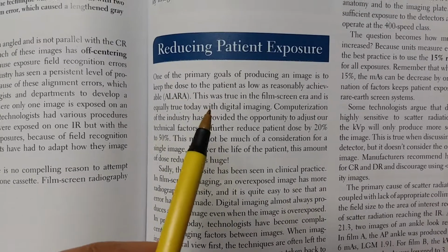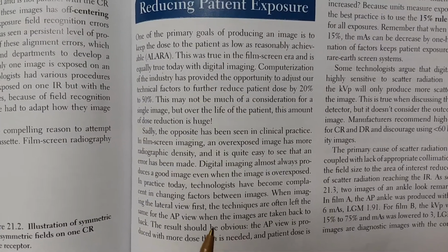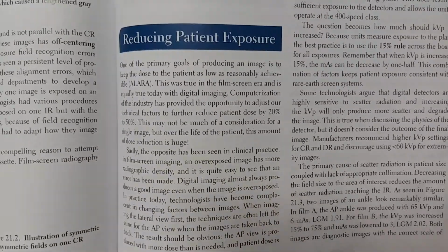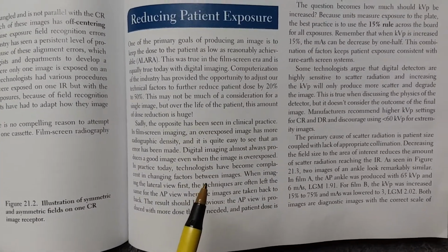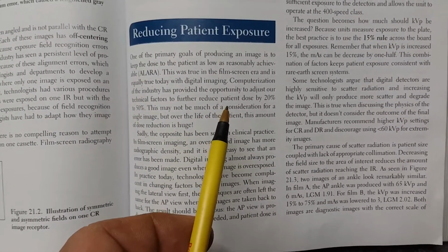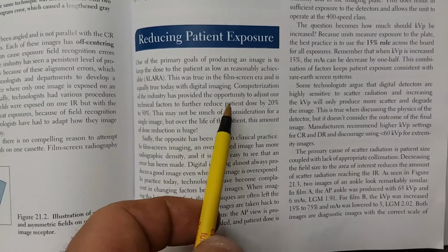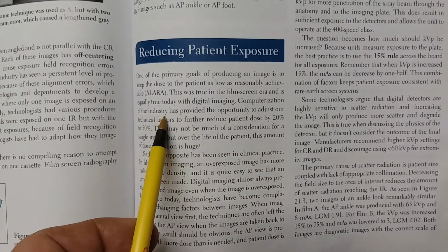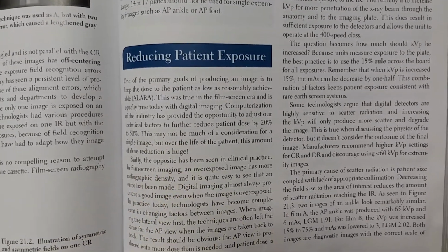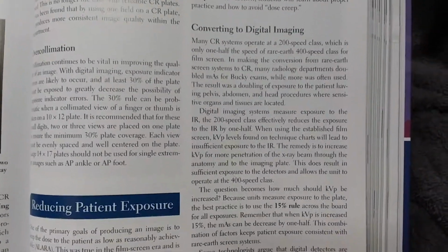Reducing patient exposure, it says the ALARA concept, as low as reasonably achievable, talks about the fact that you need to use as high kV as needed to adequately penetrate the part, and use as low an mAs as you can get. Higher kV means that you have better penetration of the part, and you can use less mAs, which is always good for the patient, because mAs is really the dose to the patient. And it says here that computerized images will allow you to reduce the dose to the patient anywhere from 20 to 50%.